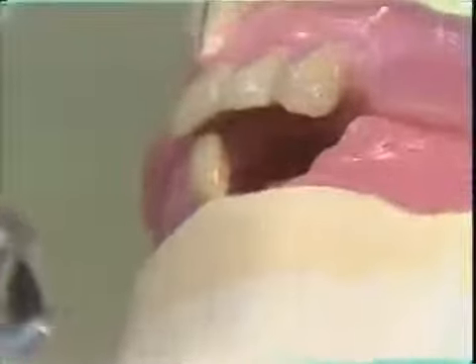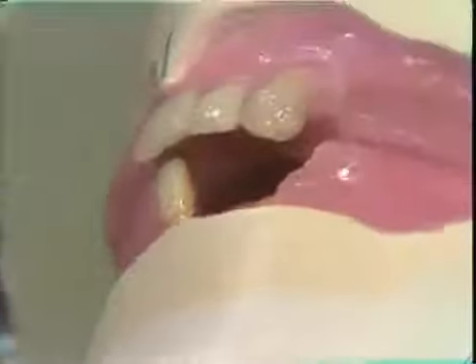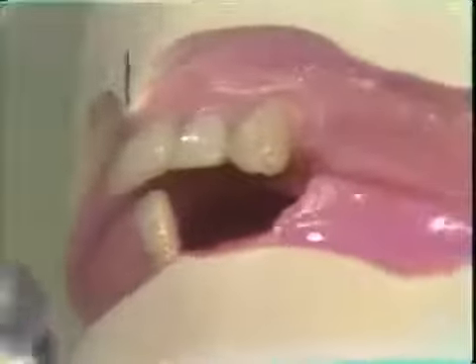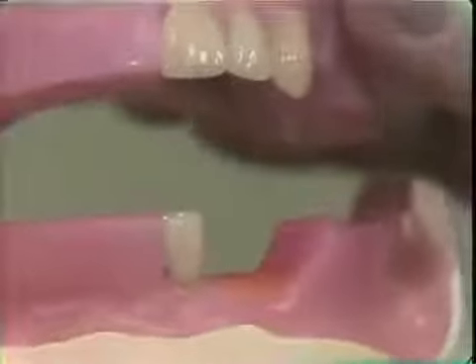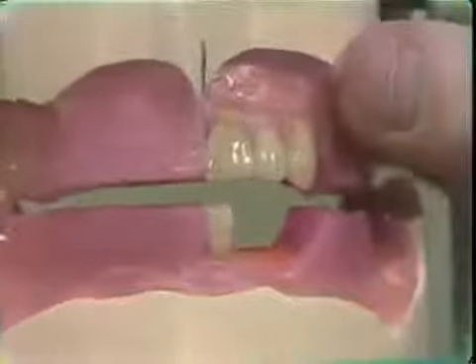wax bite rim. In this technique procedure, we're striving for a vertical overlap of 1 millimeter and a horizontal overlap of 2 millimeters. Horizontal overlap is defined as the antero-posterior relationship of the incisal edges. Vertical overlap is the superior-inferior relationship of the incisal edges.